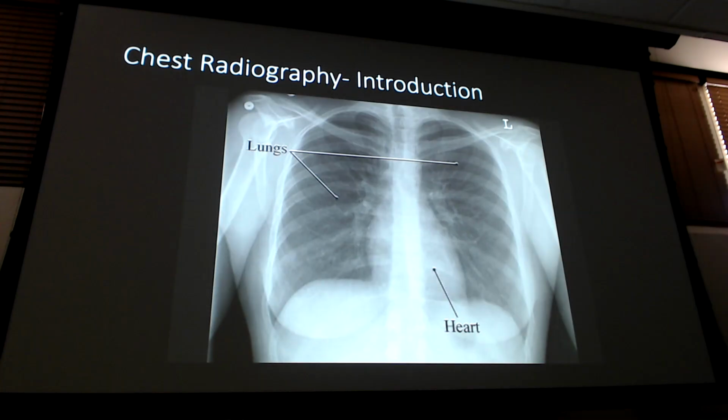So when I go back to slide 19, look at my pretty little grayish lines all over the place here, right? From like my bottom, really half to third down. I can see those all over. I don't see a whole lot up here in the apices, in the upper third, and that's good. We'll talk about that. We shouldn't see it because all these are done for the most part with the patient standing.